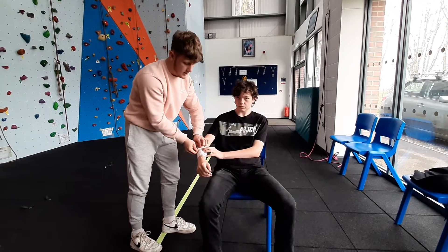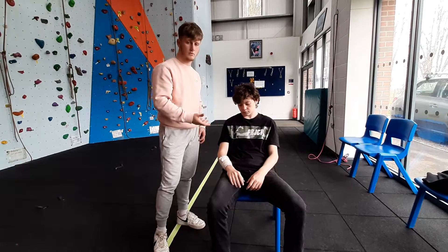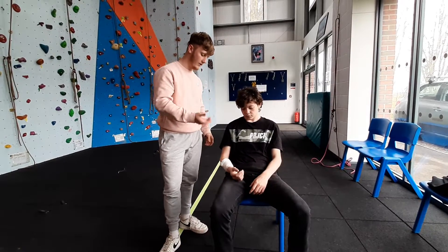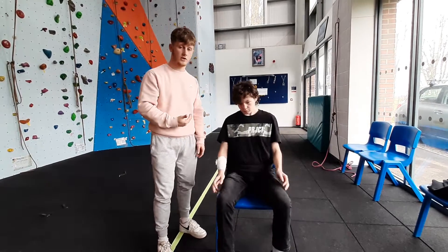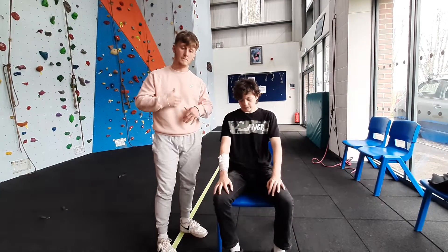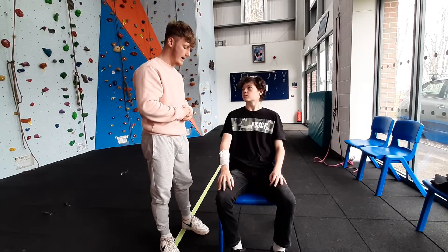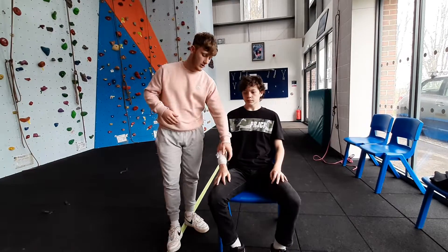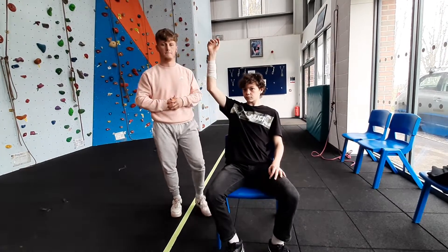Once completing the bandage, it's also key to assess the wound. If the blood is still seeping through the bandage you can apply another bandage over the top. But if the blood is still profusely coming out then you would have to take it off and restart. Another way is to also elevate the hand so the blood flow is reduced.